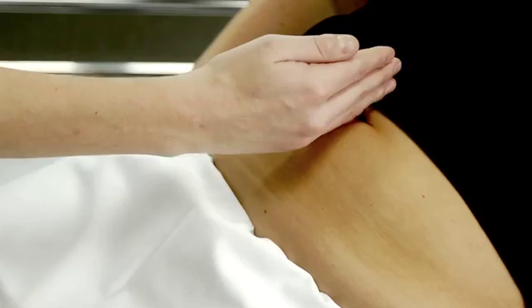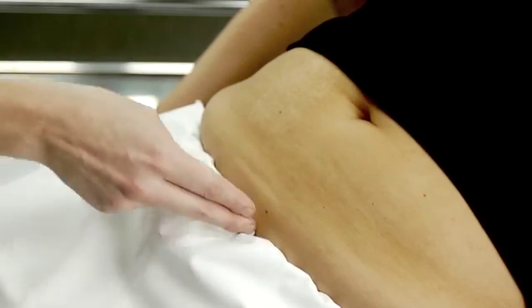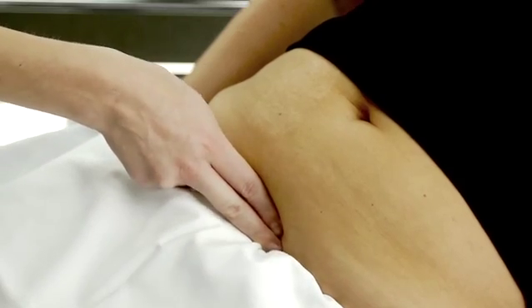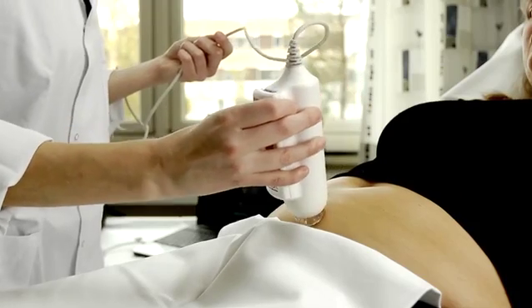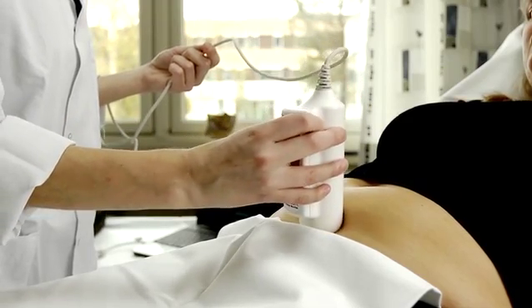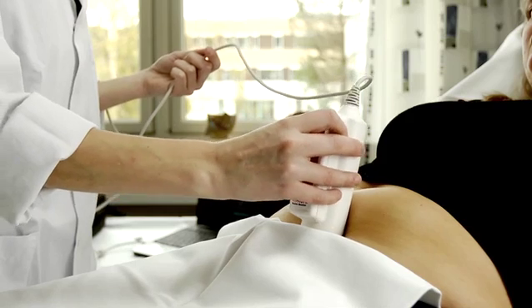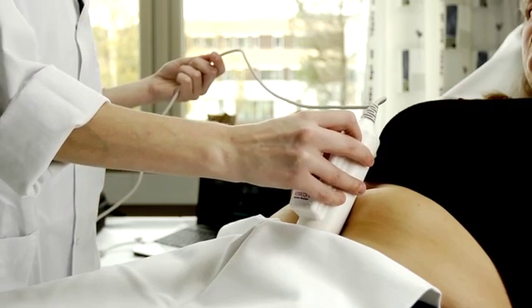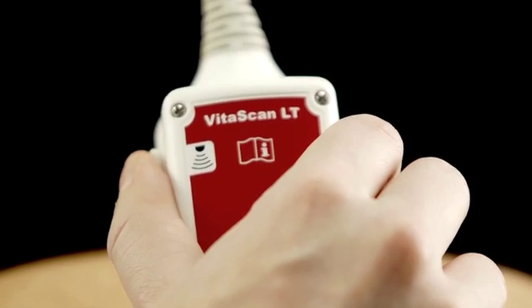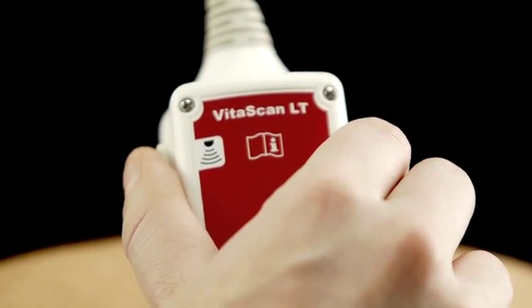Find the pubis bone. Place the VitaScan probe and move it to remove air bubbles. Press the Pre-Scan button.